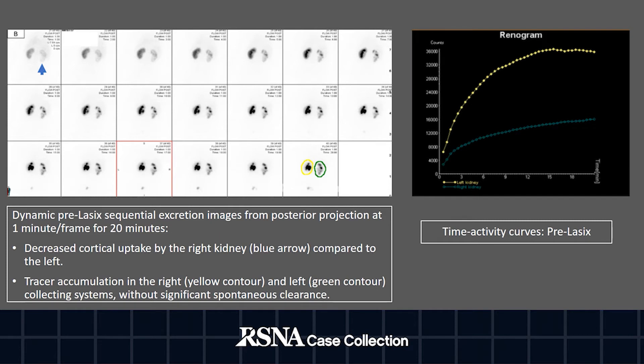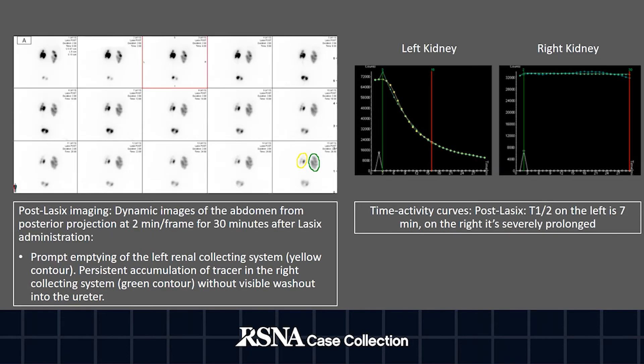At this point, we give Lasix to evaluate for obstruction versus patulous non-obstructed collecting system. Post-Lasix images at 2 minutes per frame for 30 minutes show prompt emptying of the left collecting system, which reflects on the time activity curve with a post-Lasix half time of 7 minutes, indicating absence of obstruction and consistent with patulous non-obstructed collecting system.